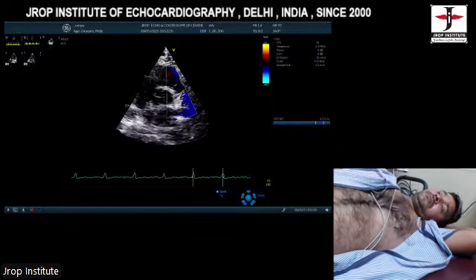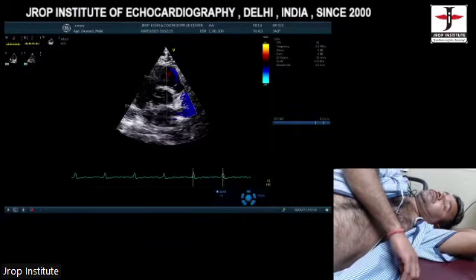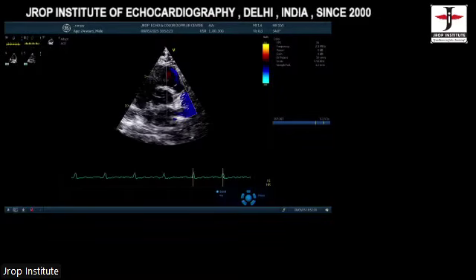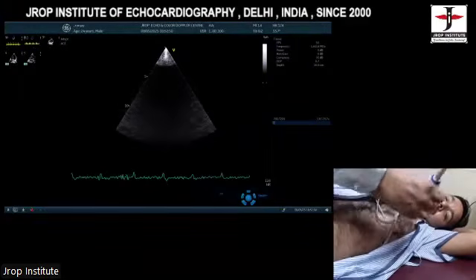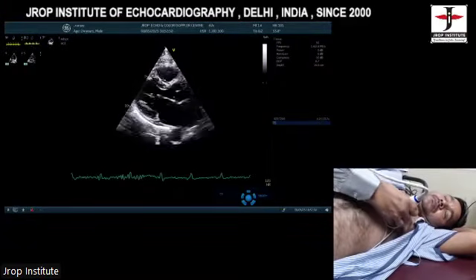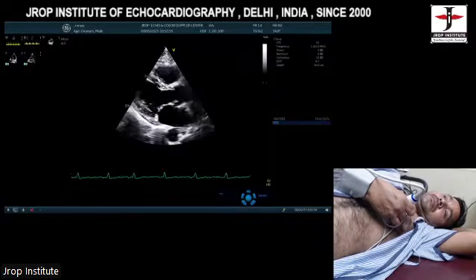Okay. Then we go to Dr. Mull. Dr. Mull, you can lower your hand and ask the question. Okay. I wish you a very good evening, sir. Thank you, Dr. Mull. So I have a couple of questions actually. The first of which is, at the time of taking the dimensions of the left ventricular cavity, what marking onto the image do we keep as reference? Just how you told that it should be the rim in case of the LV outflow tract or the aorta. So for the LV, where exactly should it be? That's the first question. And the second question is... I'll just take the second question later on.